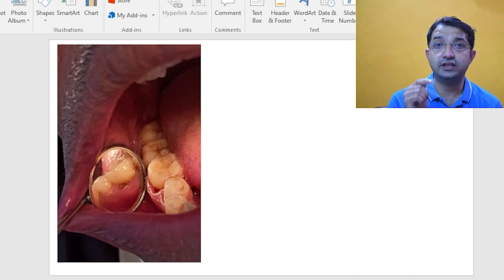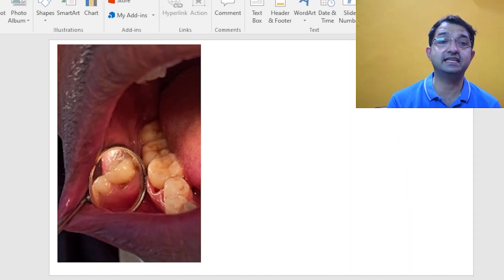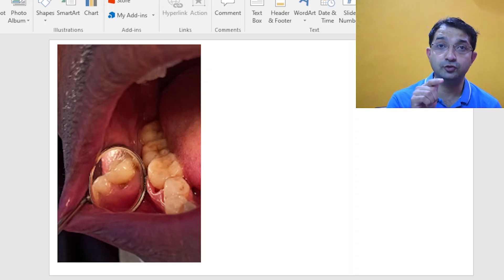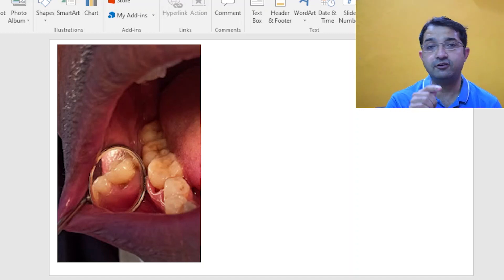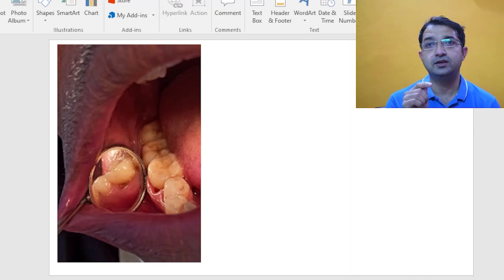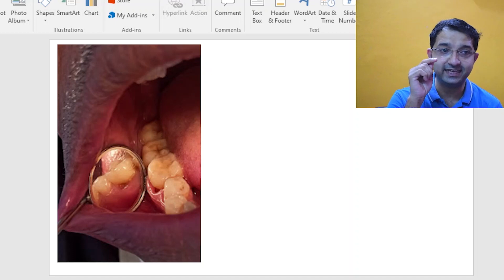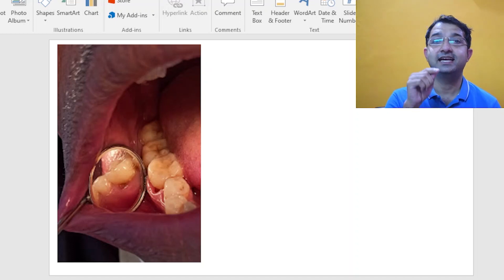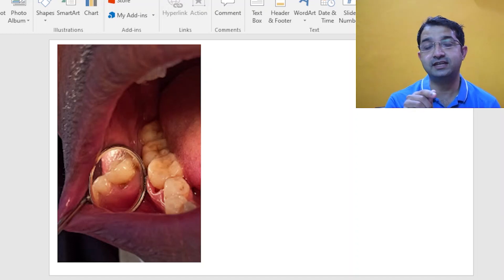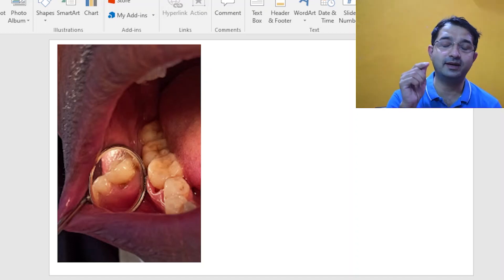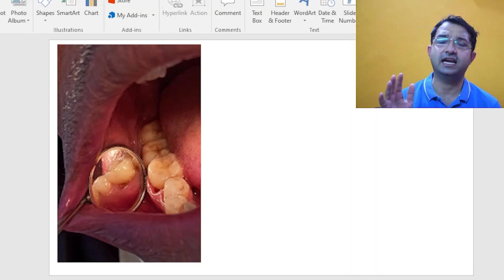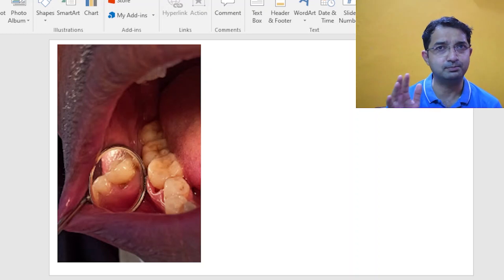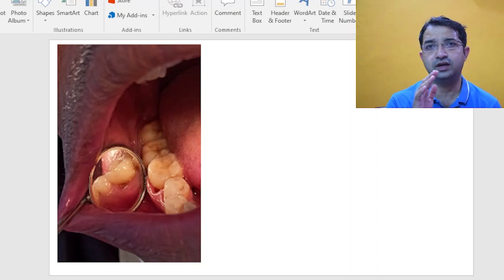If you have not seen the buccal surface you will obviously miss this lesion. Many of you who missed the x-ray and just look at the case might say okay this is a class 5 lesion and you can simply do a restoration.